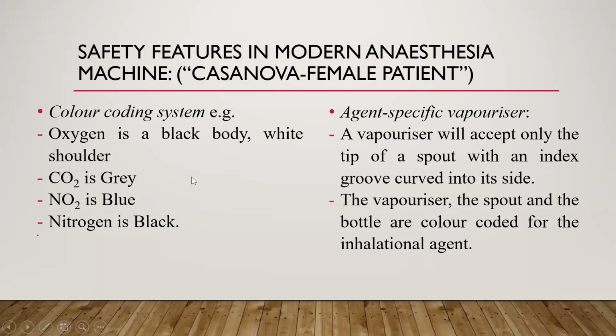Agent-specific vaporizer. Look at the vaporizer. The spout and the bottle are color coded for each inhalational agent, and the vaporizer will only accept the tip of a spout with an index groove. Guys, please learn to do this yourself.